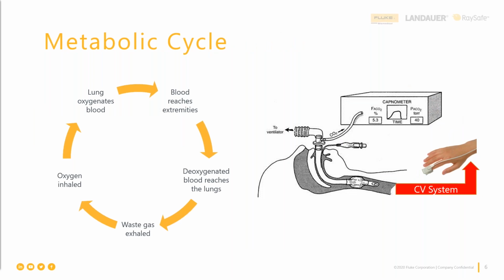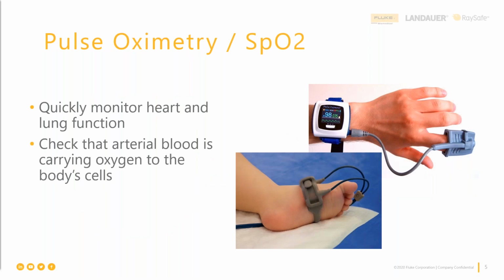Yeah, Mike, just want to add to this, there are some fingertip pulse oximeters, and sometimes people use those pulse oximeters at home. Just recently, a friend of mine got COVID-19 virus infection. Unfortunately, his wife bought a fingertip pulse oximeter to monitor his oxygen level, and one night she noticed that his oxygen dropped below 90%. So she took him right away to the emergency room. So it's a very quick way to monitor how bad your infection is. So it's getting very popular even at home, not just hospitals.